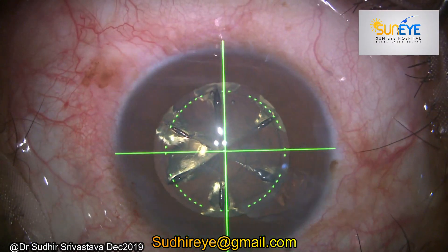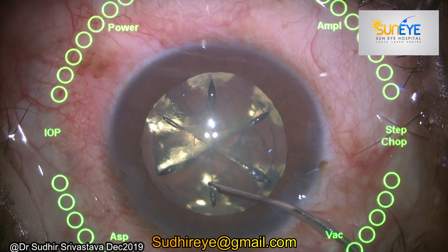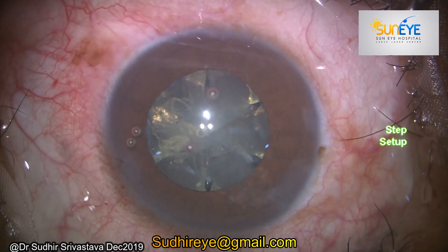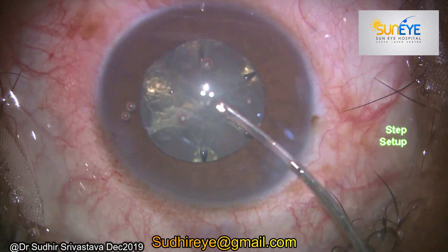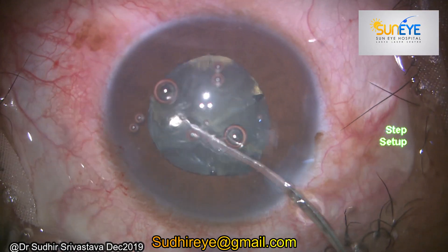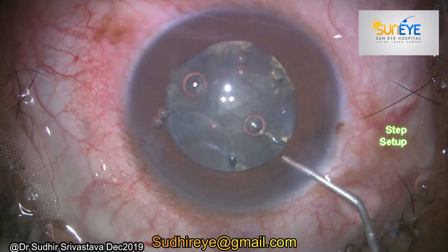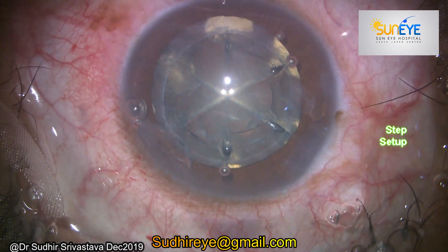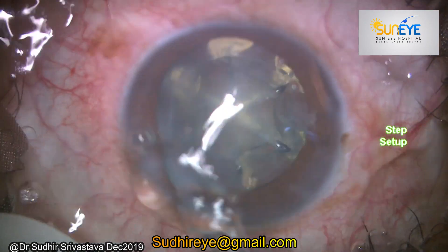This was a normal case and I did FLACS on it. I divided the nucleus into six fragments and did a 5.5 millimeter capsulorhexis. In my normal routine cases, if possible, I always try to give my corneal incision at the steep axis. I'm using a digital marking system to get an idea about the steep meridian, and after hydro procedures the eye is ready for nucleus removal.